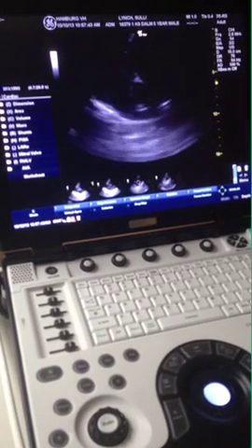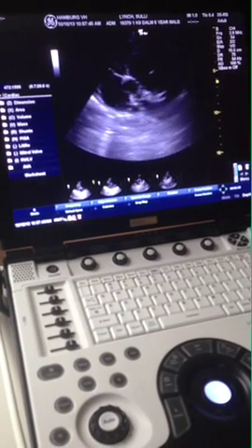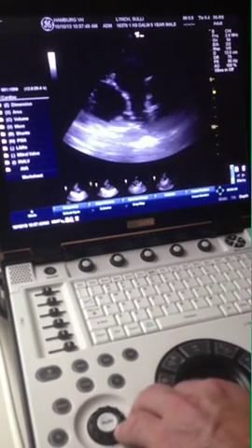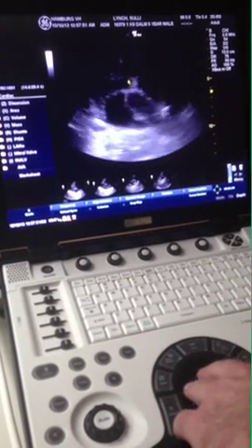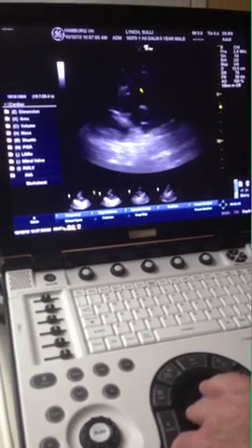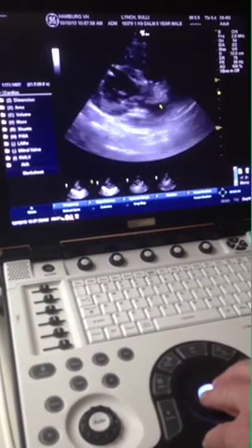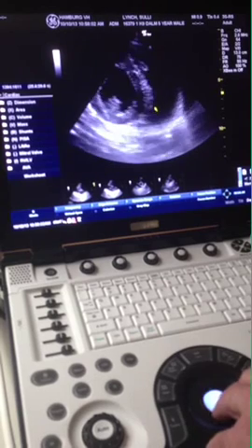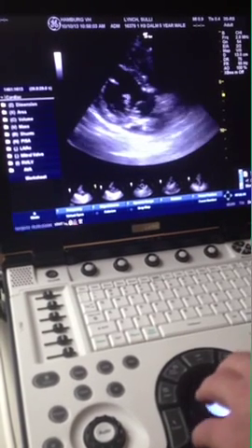From here I'll go to position two, where I'm going to cradle the rib space pointing to the right shoulder. I'll get the right atrium and the tricuspid valve. Then tail of the probe up for the tricuspid valve and right atrium, tail down for the pulmonary artery. I'll save a clip of that.